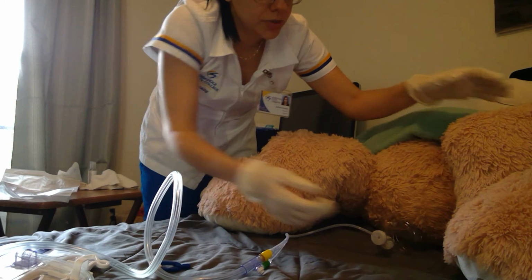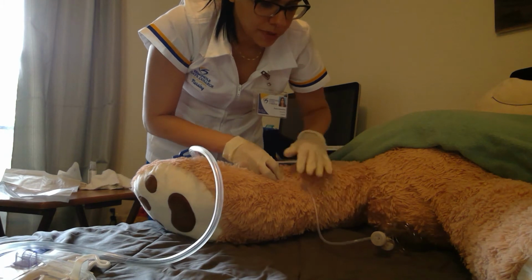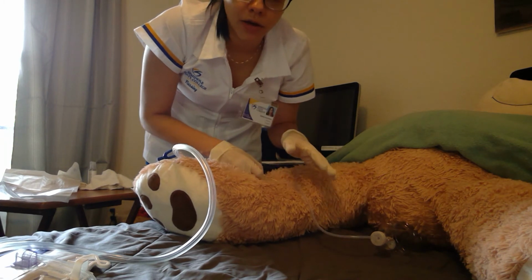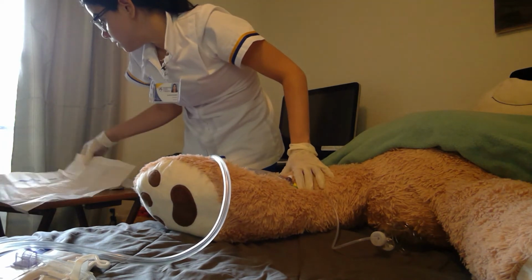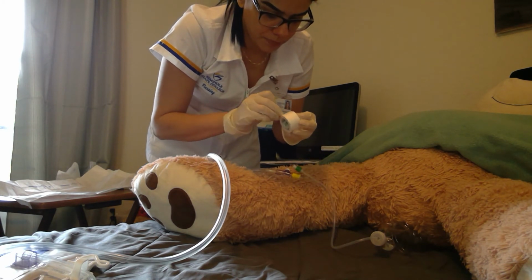So now what I'm going to do is I'm going to put her in a comfortable position again. And this, I am going to tape it to her thigh, okay? And I don't want it to be super straight, that creates tension and can cause her injury. I just want it to have some space, so if she moves, it doesn't cause any injury or any pain. Now this one, I'm going to use my tape.